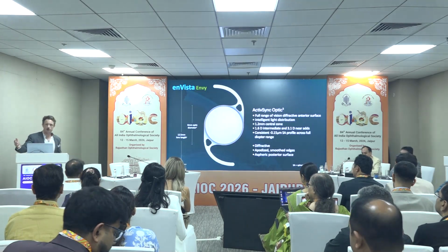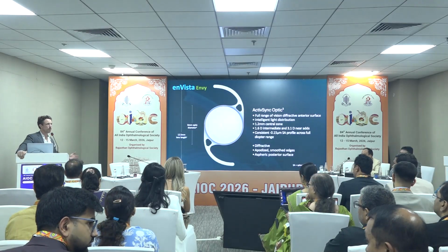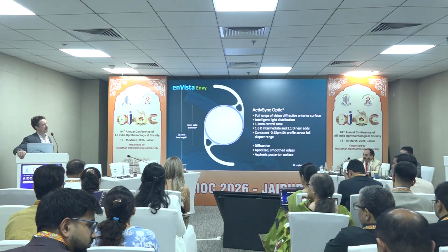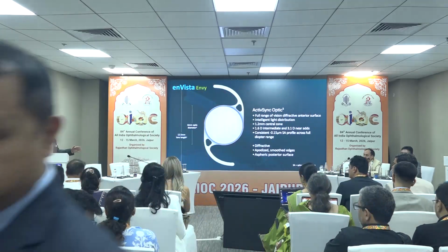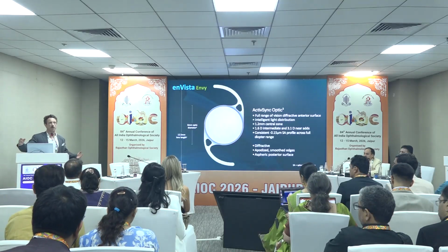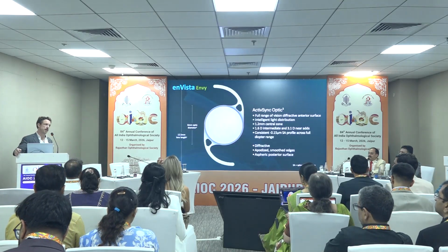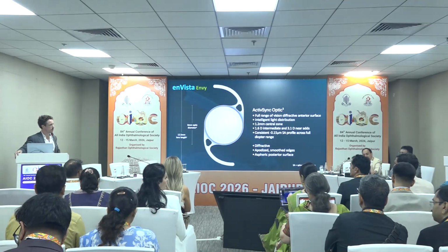And so all of these things, what I've learned with these new lenses is that all these things that we thought maybe would be a predictor of dissatisfaction are not. I just showed a case at the European Society winter meeting of inferior steepening, so an ectasia suspect, with Envista Envy, and the patients were super happy. So don't be afraid of explanting a lens. I always talk to all these patients with these little abnormalities and say maybe we have to explant, but more often than not, we're not. It's very uncommon to do so.